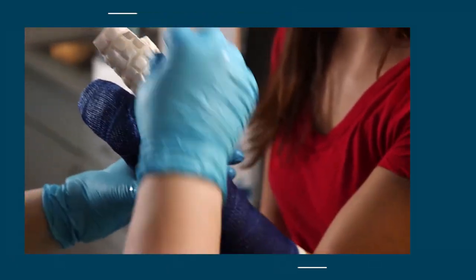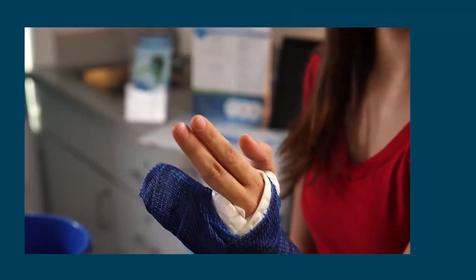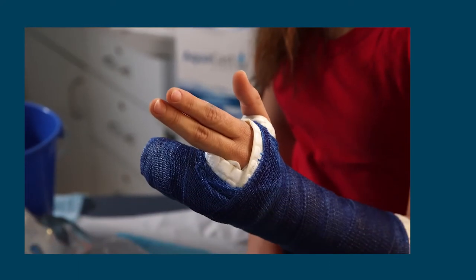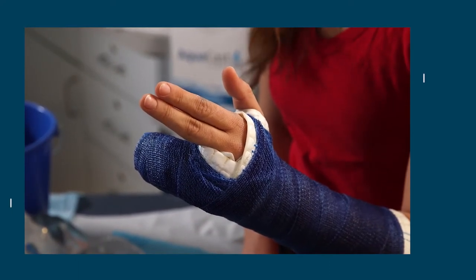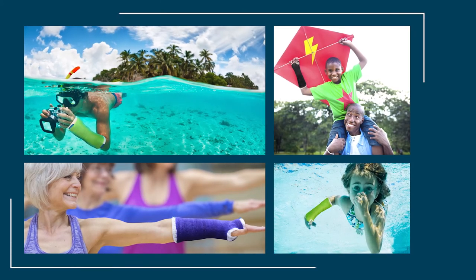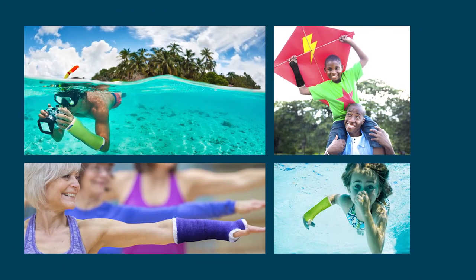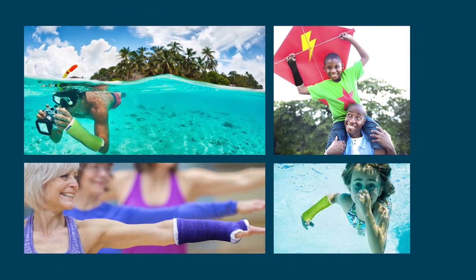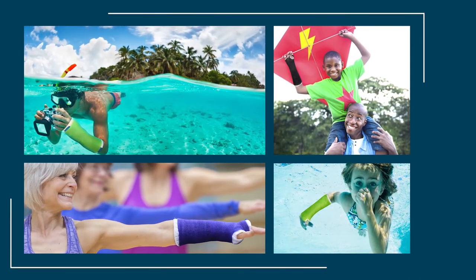Remove the extra material from around the fingers. The AquaCast liner material allows patients to go about their daily lives without worrying about getting their cast wet. Remind the patient to follow cast care guidelines and to flush their cast daily with clean, forceful water.